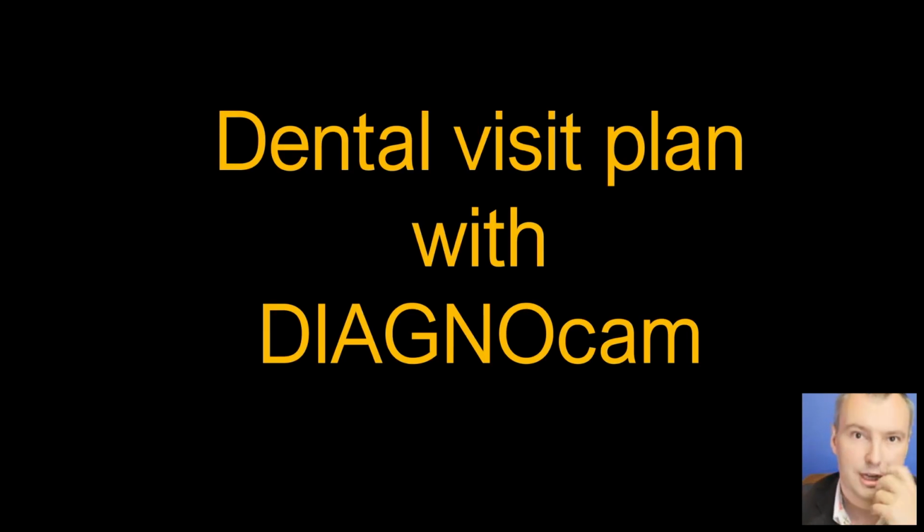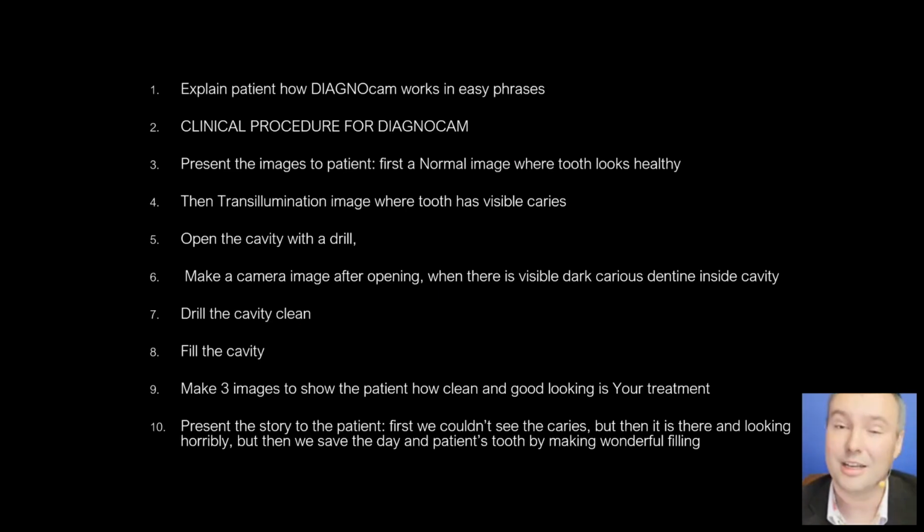So we had the procedure for the clinical use. Now we have the procedure for the whole dental visit plan with DiagnoCam, as it's a little bit different. So again, please make a picture of the screen if it's possible or if it's needed. This is how we have it all. So we start with explaining to the patient. This is also the summary of the presentation.